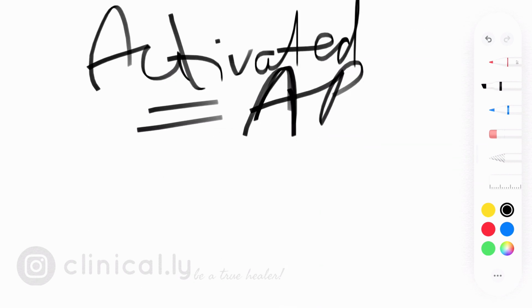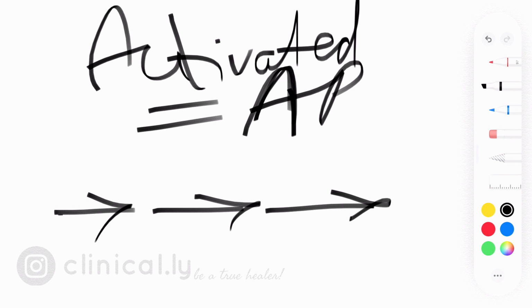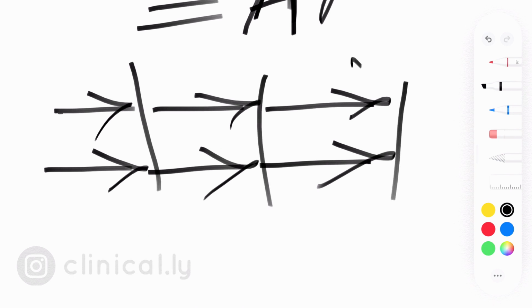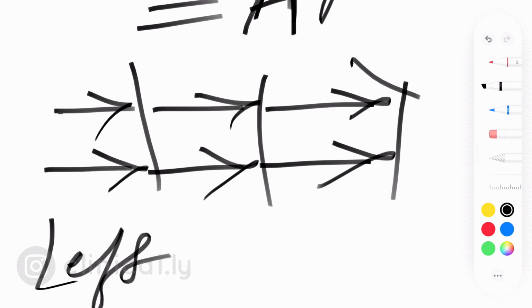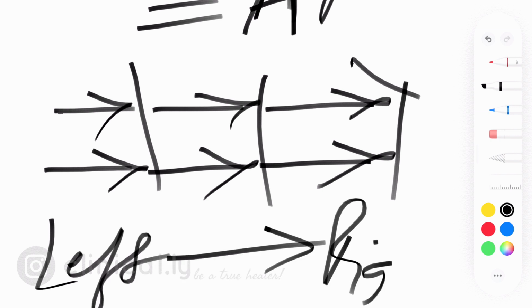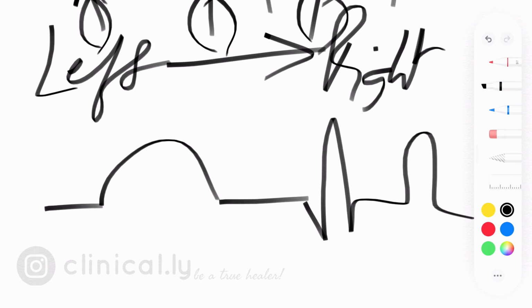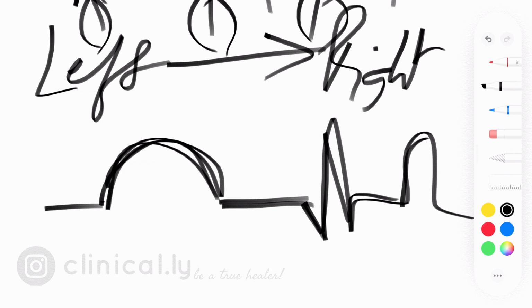And the passage of the ball from one person to the other, the passage of the activation from one cardiomyocyte to another cardiomyocyte, is called the wavefront of activation. In our given example, this is traveling from left to right. It is this wavefront of electrical activation of cardiac chambers that generates the voltage which causes deformations on the straight line ECG.